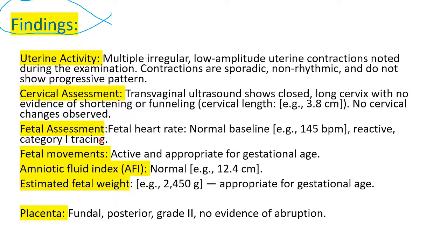So the fetal assessment is also prudent and critical when someone is having these contractions. In this report, I will just put a little bit of detail because this is not a report for the pregnancy itself, but I just need to highlight the relevance of the contraction of the uterus.